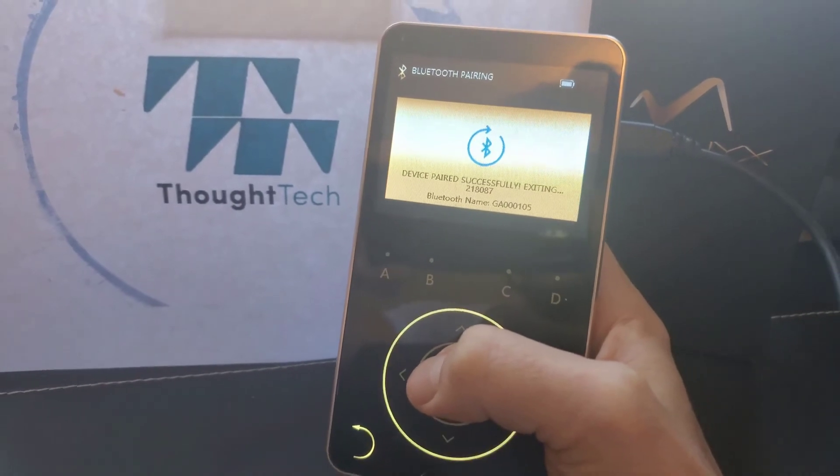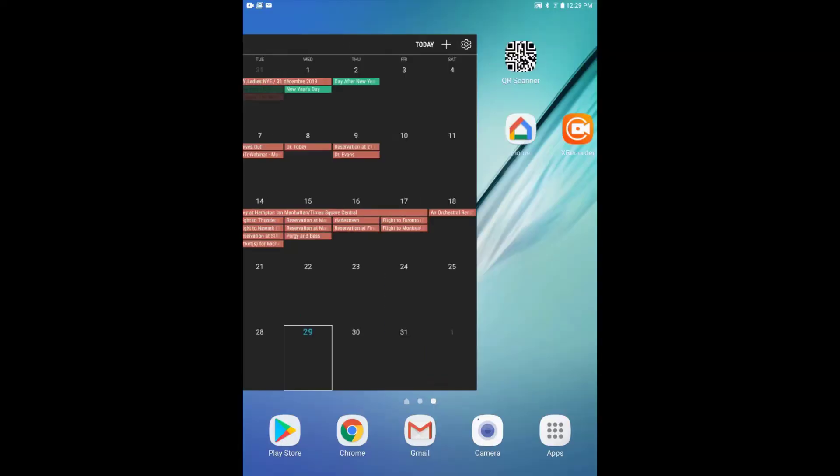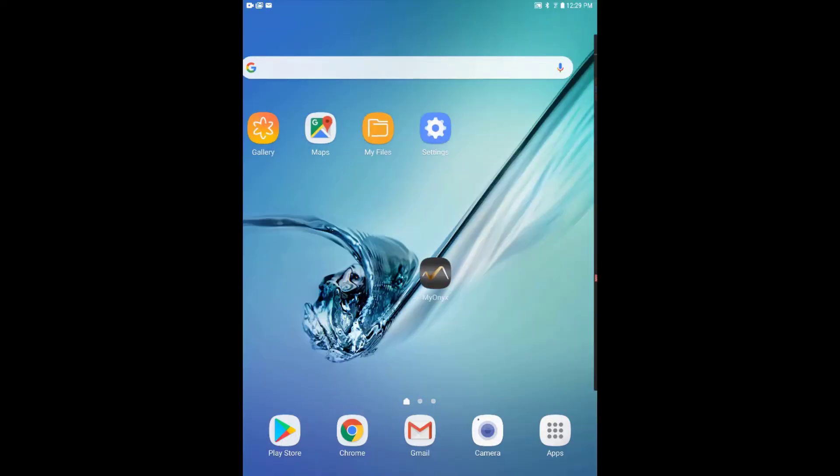Once you have the app on your tablet and your Myonix device has been paired, you are ready to go. To start the app, click on the Myonix icon.